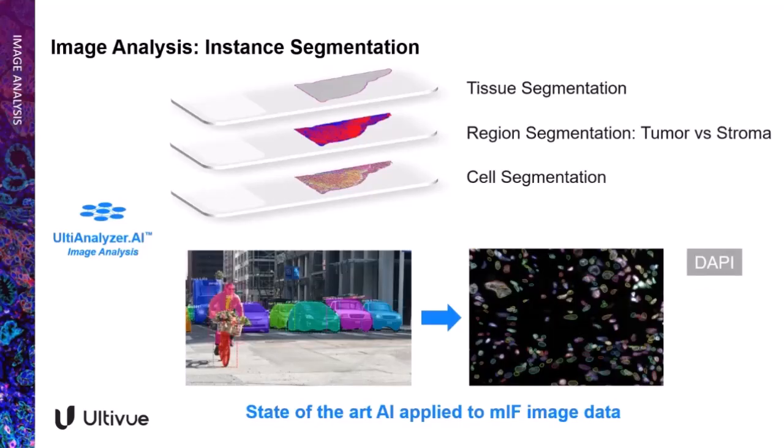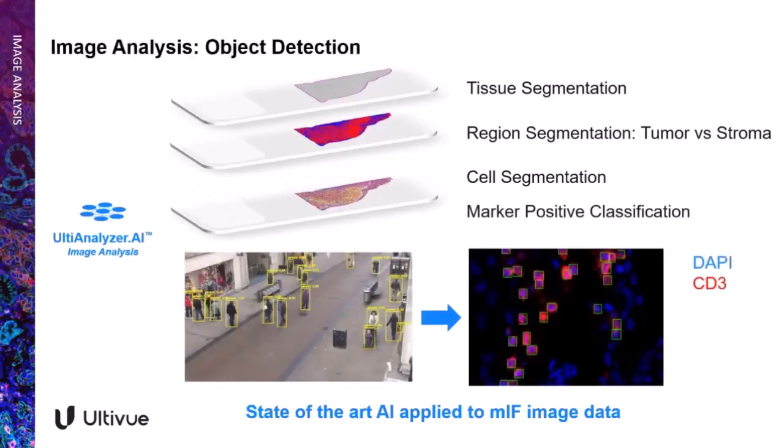I mean, this is an instance segmentation, really finding every instance of a nucleus done on DAPI on high magnification. I would say until now that's all pretty standard in the current approaches. What is really remarkable and most differentiating is the next step, where we classify the positivity for every marker in the panel. And we do that not based on thresholds measured within these cell objects, but we actually, again, train a deep learning method.